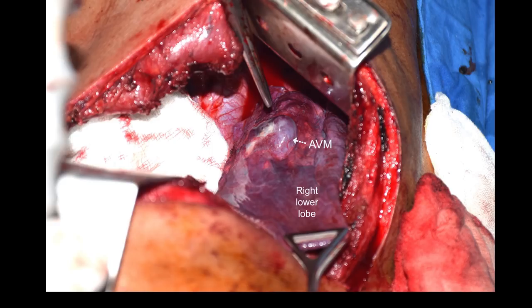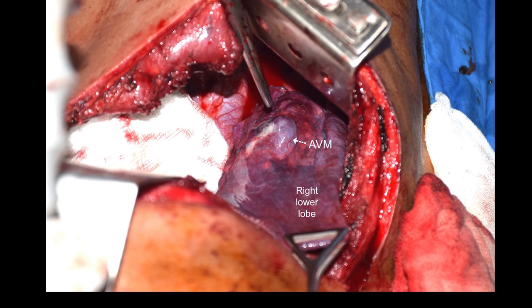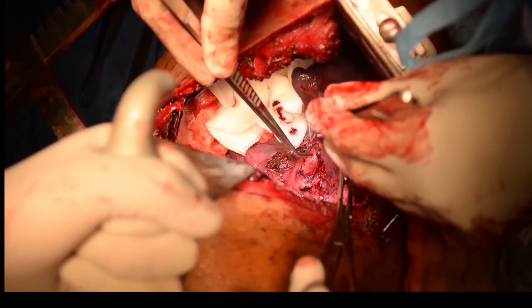A standard right posterolateral thoracotomy was done, and on collapsing the lung we could see the right lower lobe with a huge, very angry-looking arteriovenous malformation. From our knowledge of the 3D print and the CT scan, we knew exactly where to proceed.